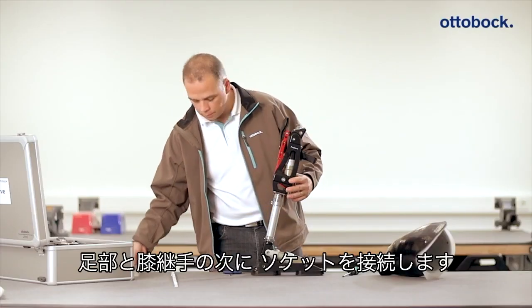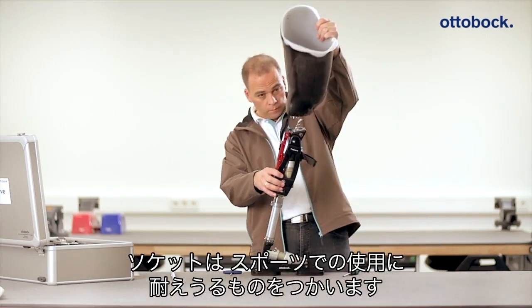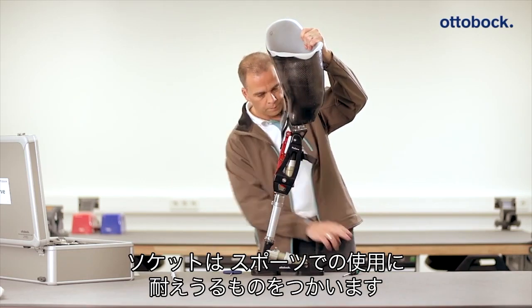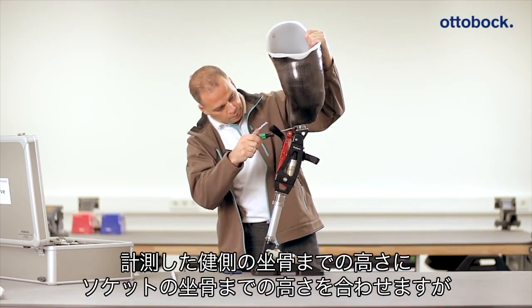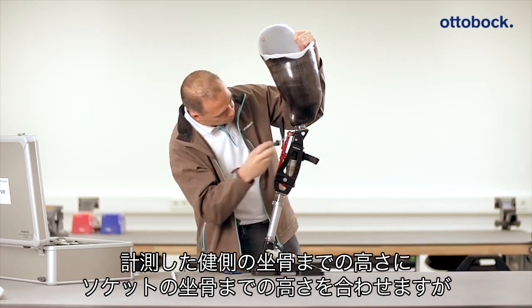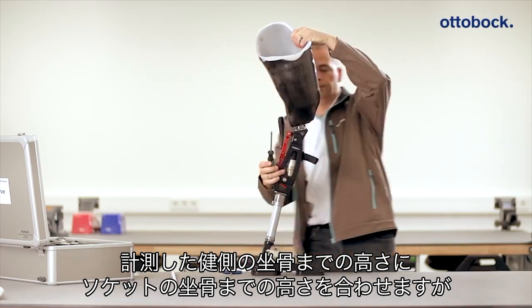Once the components have been connected to each other, the socket is attached. A definitive socket must be used that can withstand the high stresses of sports. Position the socket so that the ischial tuberosity reference point is located at the height of the ischial tuberosity to floor measurement.